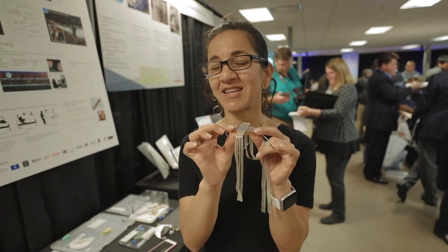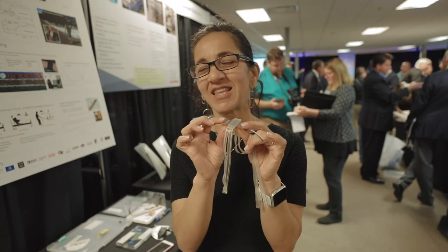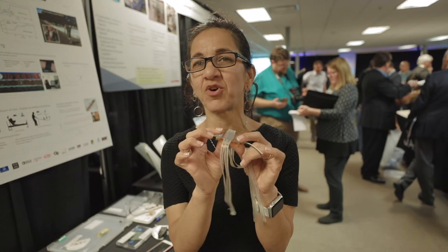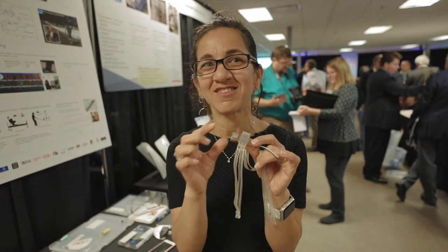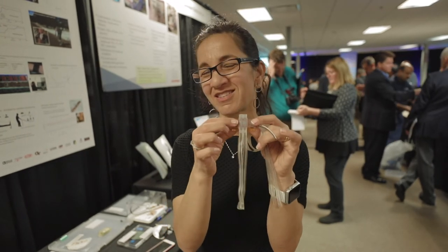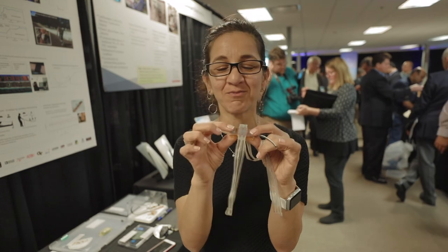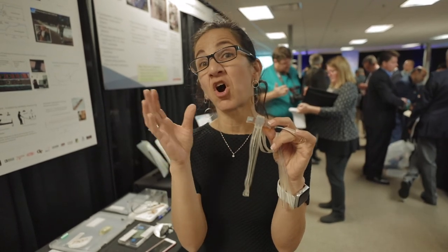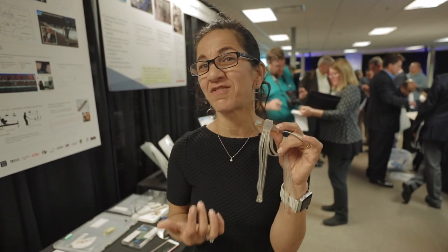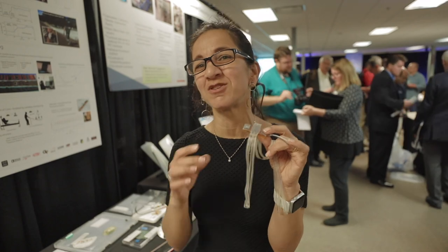That low cost enables single-use devices that can be disposed of, which is important in clinical settings for prevention of infections and also for the workflow of nurses — they don't have to recharge or disinfect these devices. Very importantly, we could be using them in all patients, which could actually achieve earlier discharge of patients and reduce medical errors.